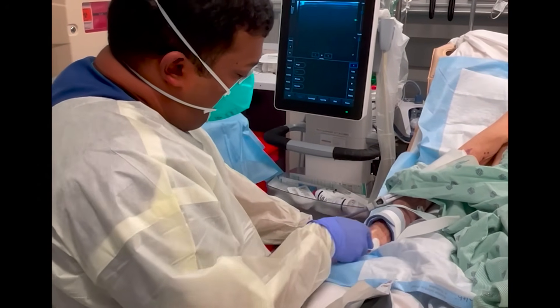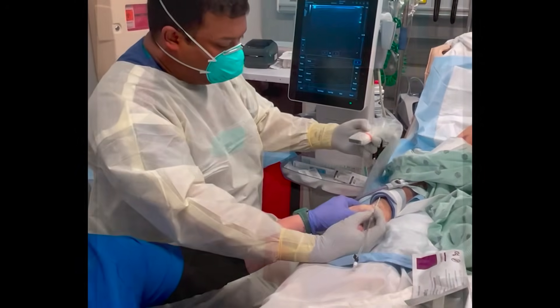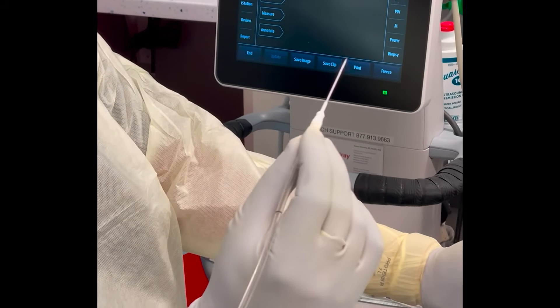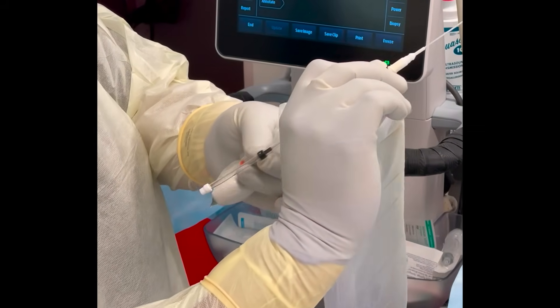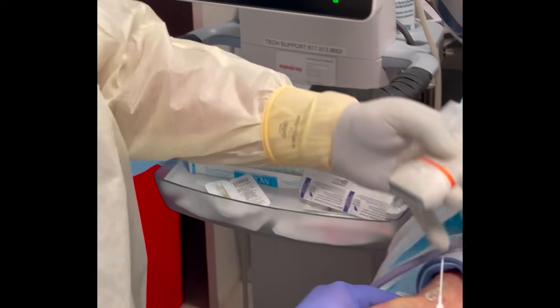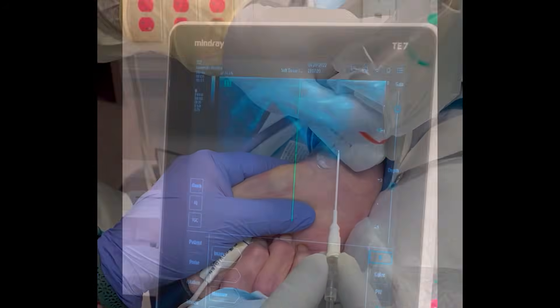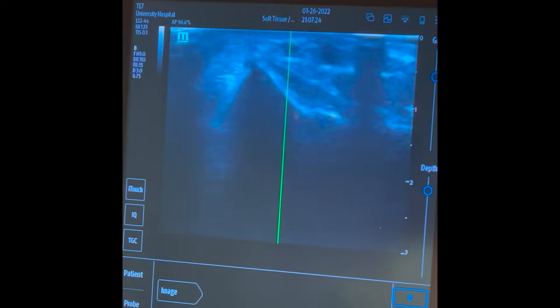We have our arterial catheter kit, which has a needle and the catheter all in one and a guidewire that you can advance through — all built into one unit. Now I'm going to find my vessel again. That's the artery right there — we'll line that up in the middle.